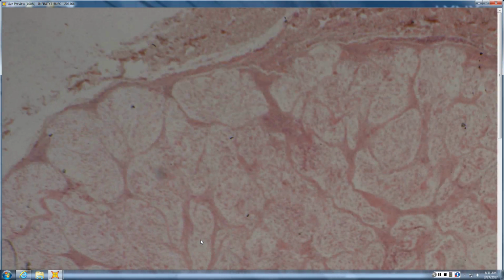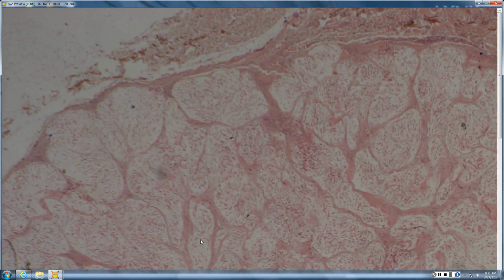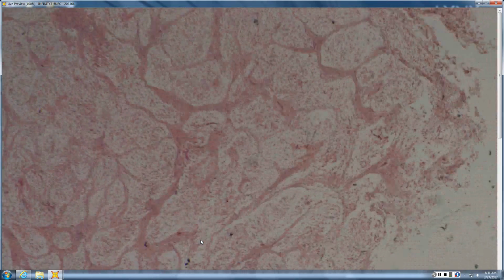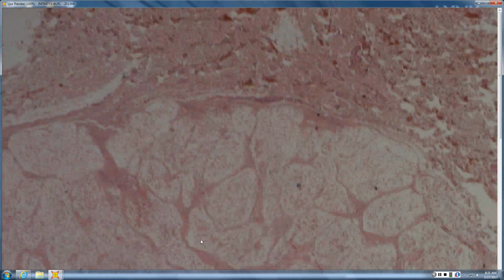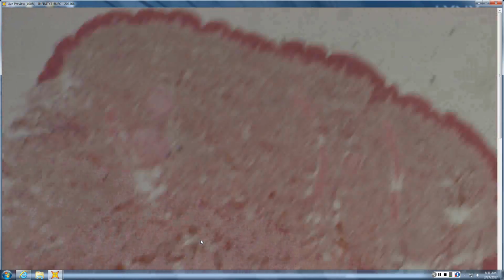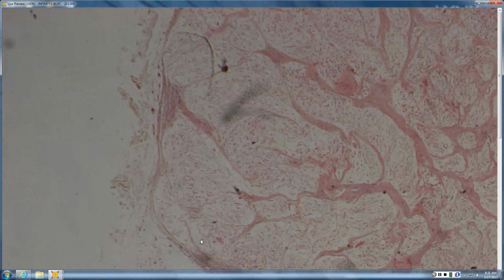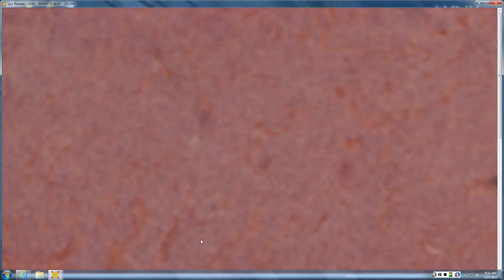So they're like myxoid fascicles, but just deeper. Deeper, but with myxoid fascicles with stellate cells. It's like a myxoid neurothekeoma or nerve sheath myxoma. What stain? That's one. Okay, and last one, just to walk you through it.